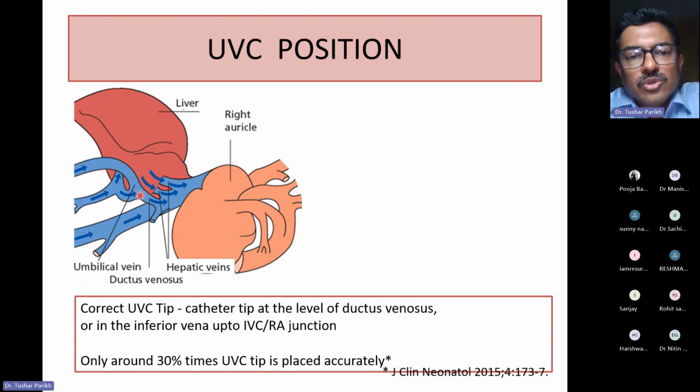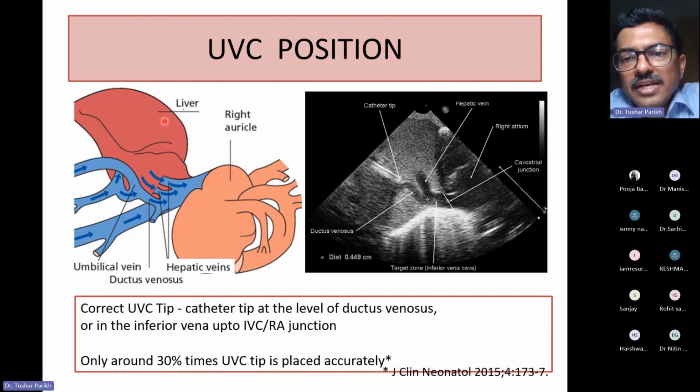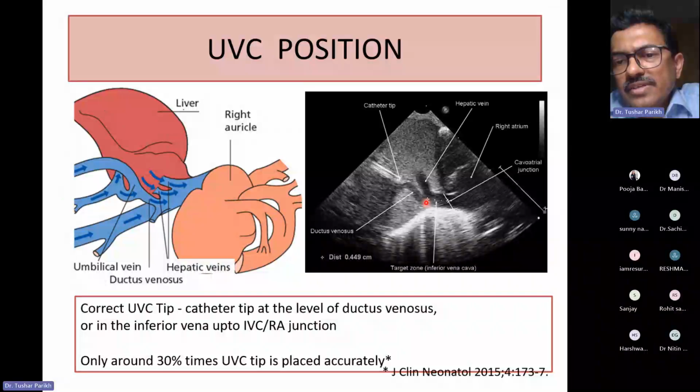Okay, so let's begin now. Once we understand this anatomy, it will be easier for us to see. As I said, on the ultrasound, you're doing ultrasound from the top here. This is the liver parenchyma. Now this is a hepatic vein. Now the catheter is coming from up like this from the umbilical vein. The catheter is stopped here and the ductus venosus is here. This is the area where you ideally want the tip position, from the ductus venosus IVC junction to the RA IVC junction. It should be in the IVC basically. But if it is in the ductus venosus, it is acceptable because there is no tributary or any issue there. So this is how it will be seen.